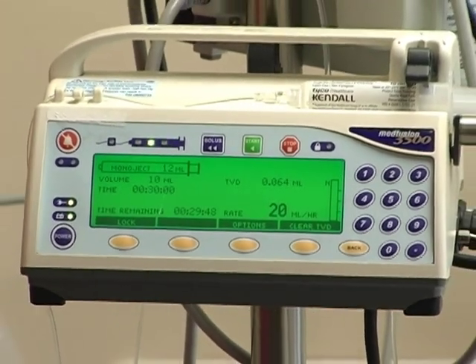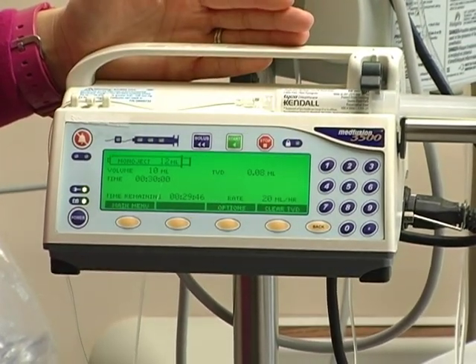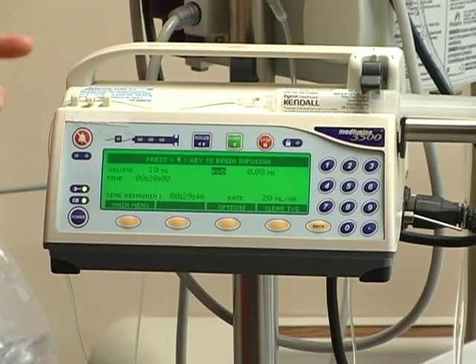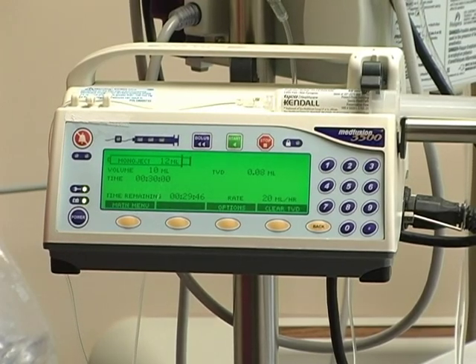At any time you need to stop the infusion, you just hit the stop button and that will stop it. Then you can restart if needed. The other key that is important is the silence button, if you need to silence any alarms.